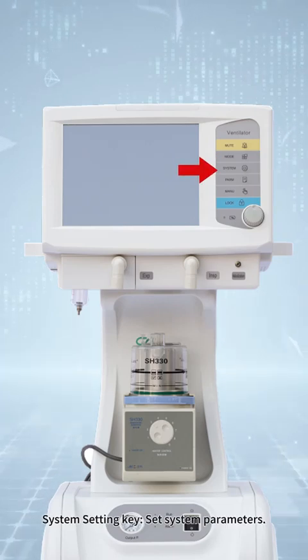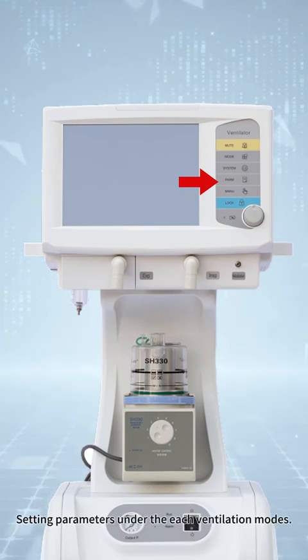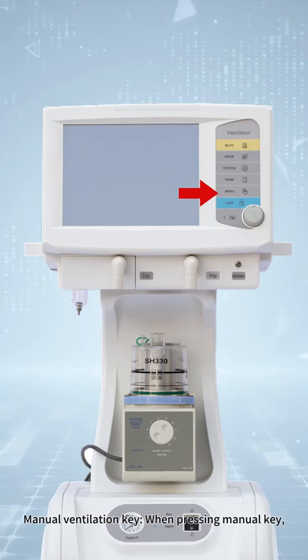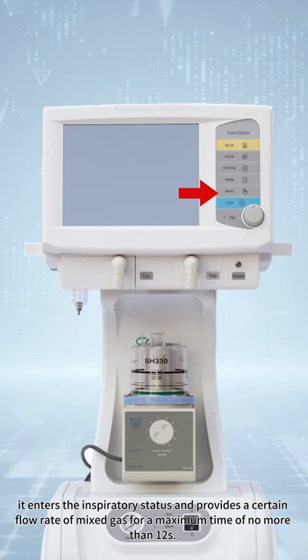System setting key, set system parameters. Parameter setting key, set parameters under each ventilation mode. Manual ventilation key: when pressing the manual key, it enters the inspiratory status and provides a certain flow rate of mixed gas for a maximum time of no more than 12 seconds.